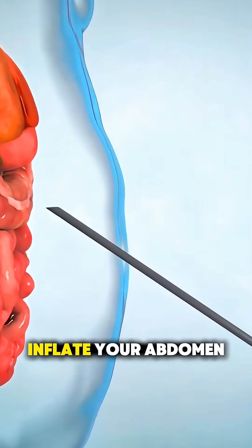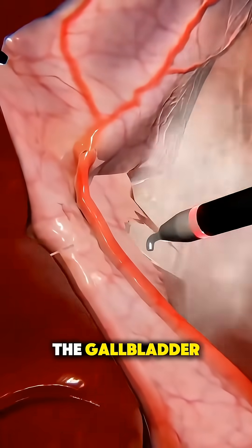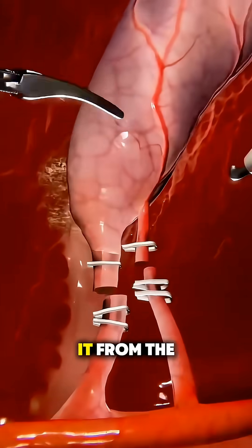Next, they gently inflate your abdomen with gas to create space to work. Once inside, they carefully locate the gallbladder, clip and cut the small ducts and blood vessels attached to it, and slowly separate it from the liver.